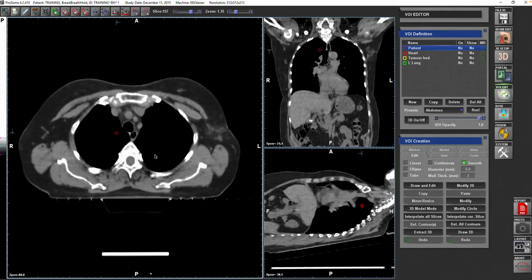These are very simple lectures, usually divided into two parts. The first part is just anatomical landmarks that you are going to use for the target volume delineation in breast cancer, mainly the lymph nodes, because it's easy to delineate the breast and it's easy to delineate the chest wall. So I just thought I will focus on the target volume delineation of the breast regional lymph nodes. In the first part, you just need to familiarize yourself with certain anatomical landmarks. And in the second part, I'll give you a very simple method to delineate quickly all lymph node levels in no time.